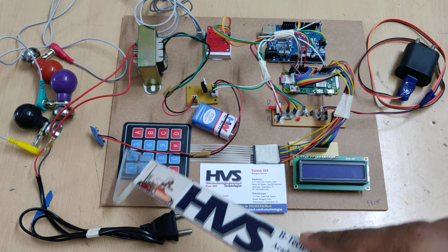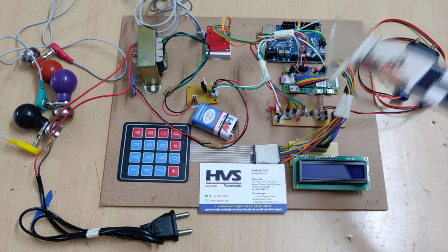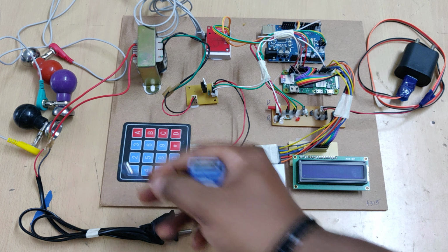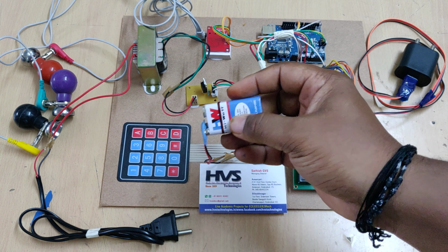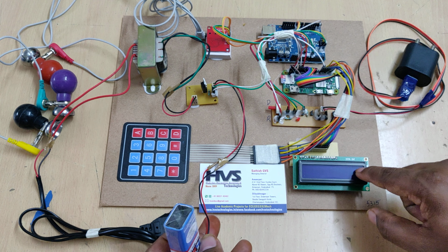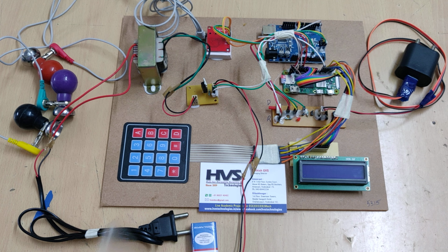So that will be entered from this 4x4 matrix keypad. Based on this abnormal disease detection, the Raspberry Pi will turn on the pacemaker. The pacemaker is controlled by this 9 volt battery, so we need to connect the 9 volt battery to this one properly. Whenever the Raspberry Pi has booted successfully, there will be a welcome message on the LCD screen. After that only we need to connect this battery to the defibrillator pacemaker.